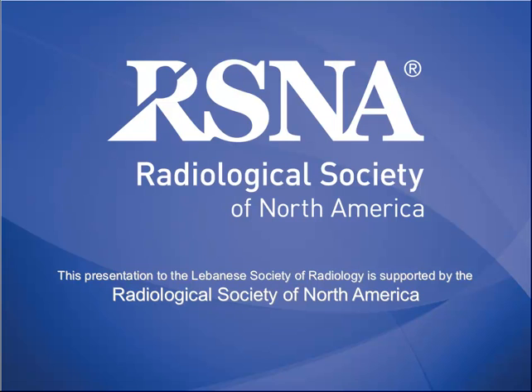We don't use the specific dual energy applications at the moment for pediatric applications. It's just that there are 2 tubes that allow the imaging to be obtained very quickly, in twice the speed that you would do with a single tube. So, at almost the same or even lower dose. So it's really an incredible technological development that we are welcoming. I'm very glad that in Lebanon there is similar experience, apparently.